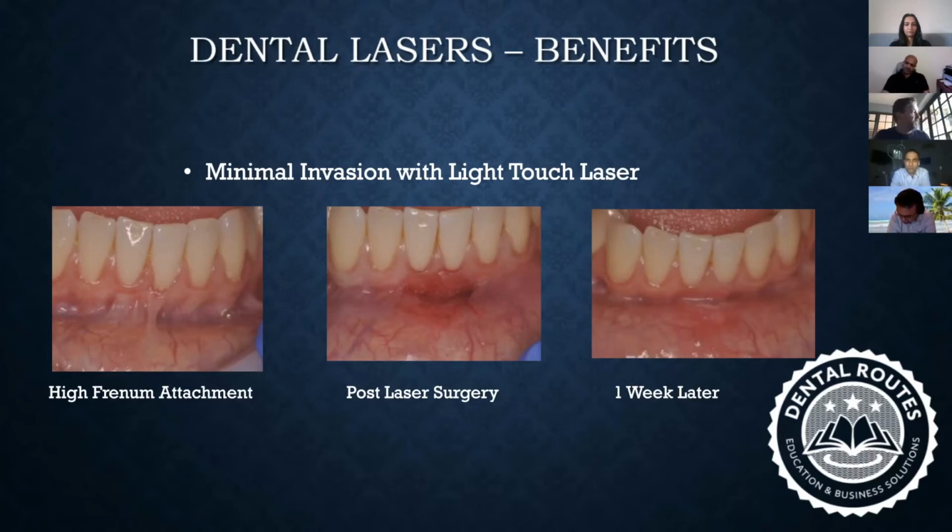The second thing that it does very well is, as I was explaining, in a low energy mode to the surrounding structure, it is charging up the batteries of the cells. And as it is charging up the batteries of the cells, repair is now becoming far, far more superior than a normal healing. Okay, guys, I'm using words which are extremely laymanish. If someone feels, okay, this guy is just talking about cells and batteries, forgive me. But as we go, we can go into details about ROS and how oxygen exchange happens, how different cycles work, and so on and so forth.